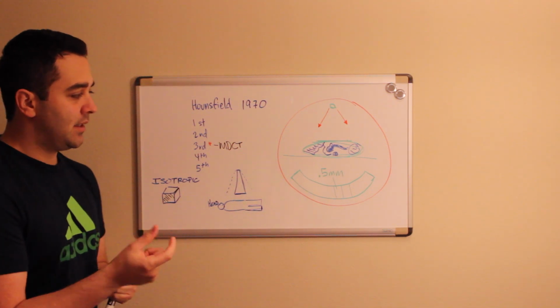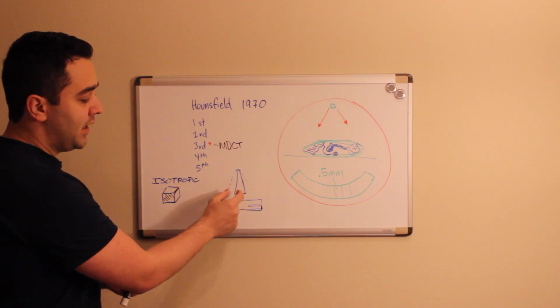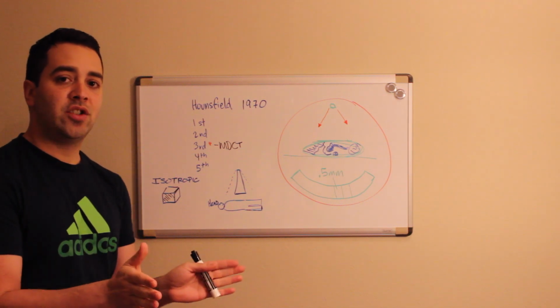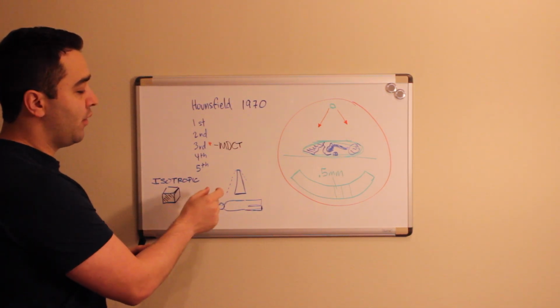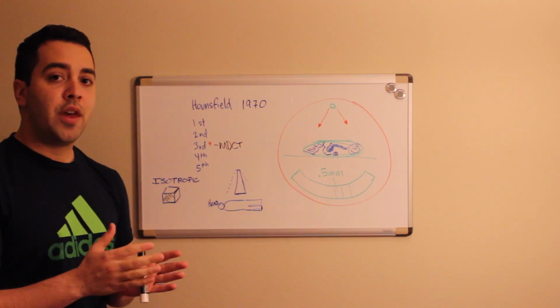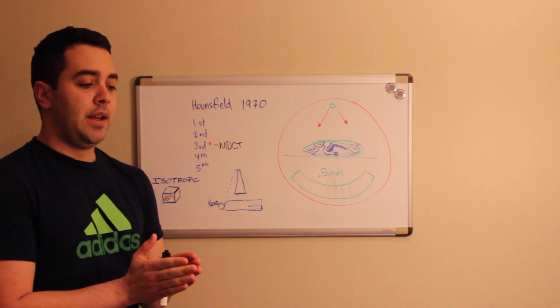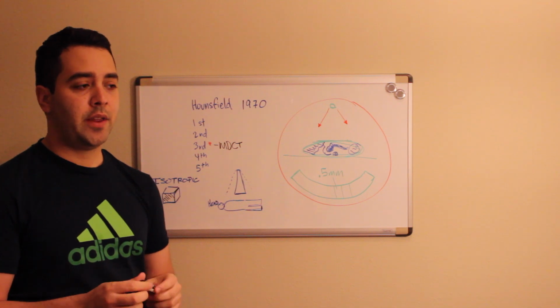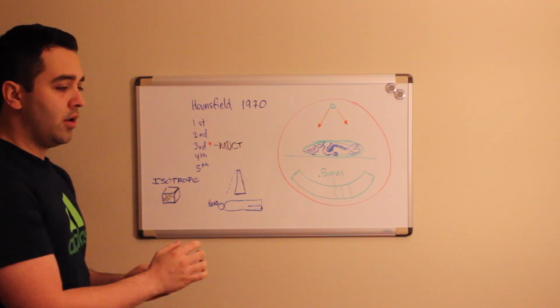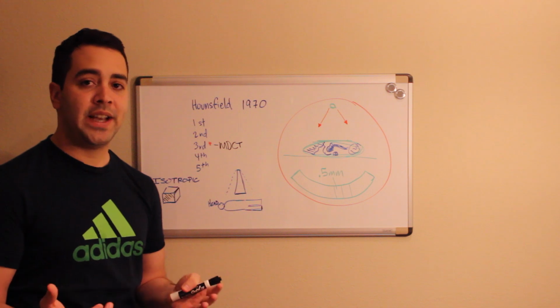In terms of the thickness, nowadays we use approximately a 0.5 millimeter thickness for the x-ray beam. The third generation scanners have a fan-shaped x-ray beam, so we use a 0.5 millimeter thickness. However, we often do reconstructions that are thicker than that, and the reason we do that is because we can actually have a better contrast. And just think of it in terms of noise. The thicker our voxel, I think of it as a basket, we're able to take more photons, and therefore we have more data.